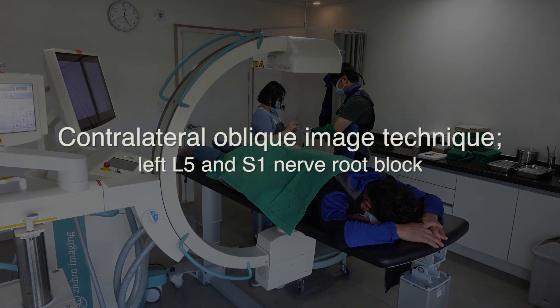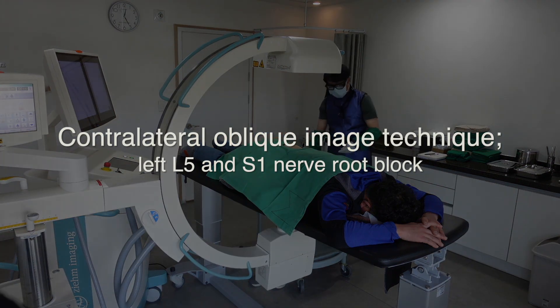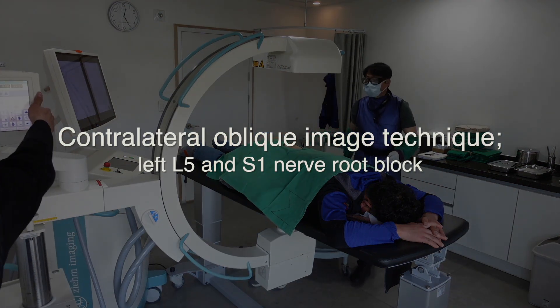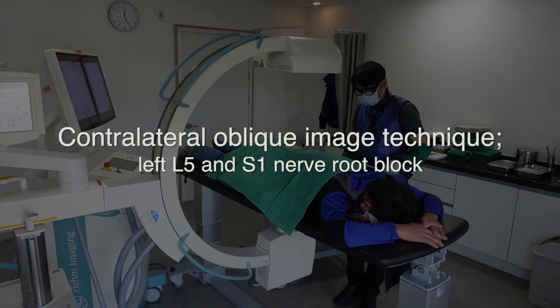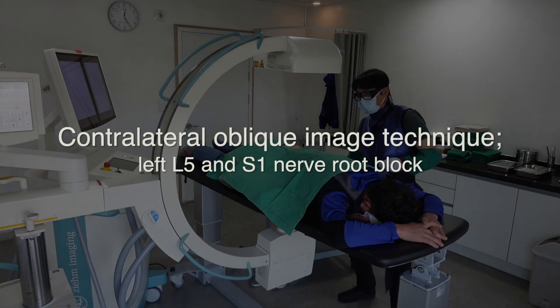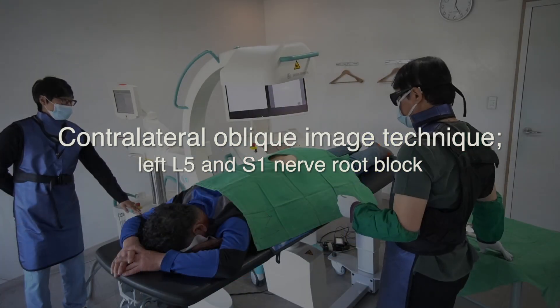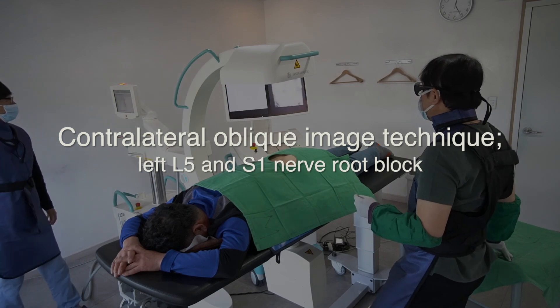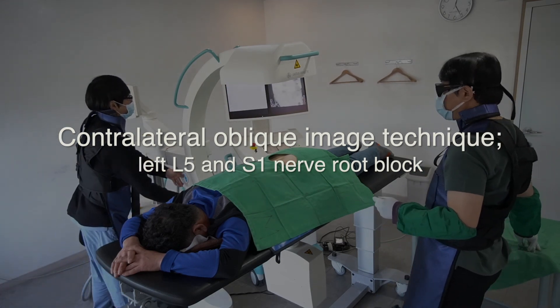Welcome back. This video will show you the left L5 and S1 nerve block using Ipsilateral Oblique, AP, and Contralateral Oblique C-arm image guidance.